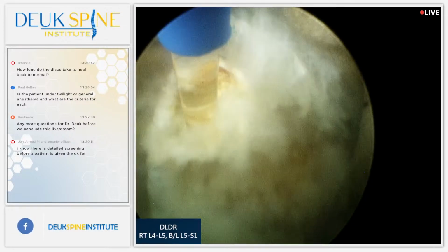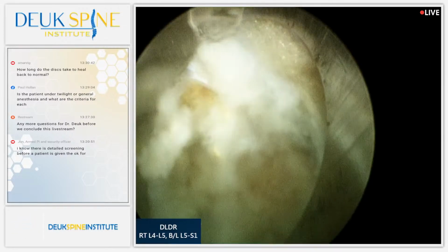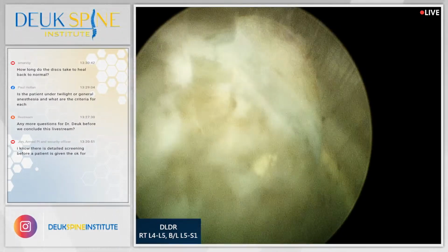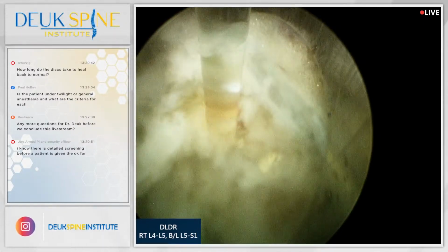All right, just about done. It's all herniation at L5-S1.